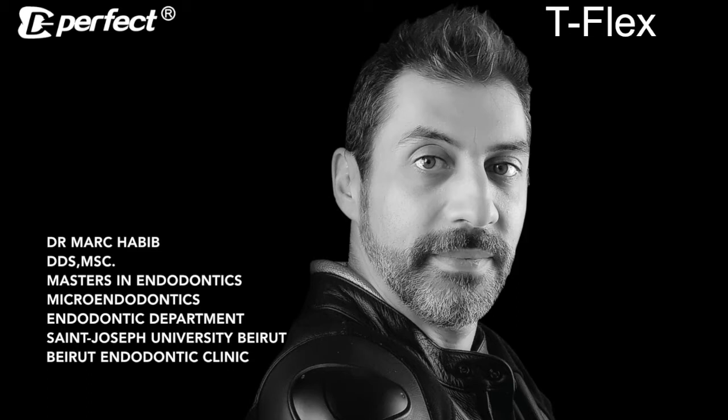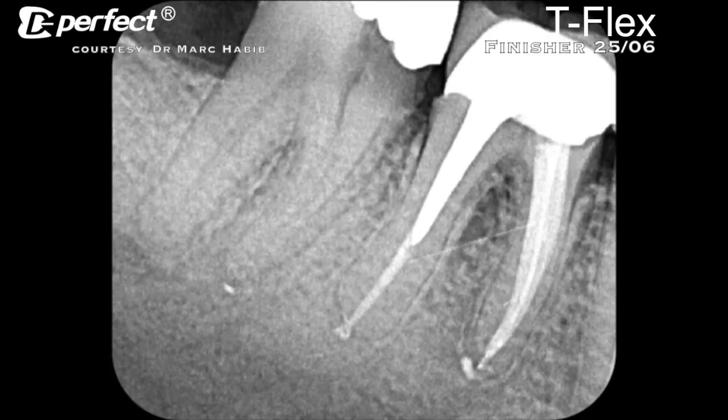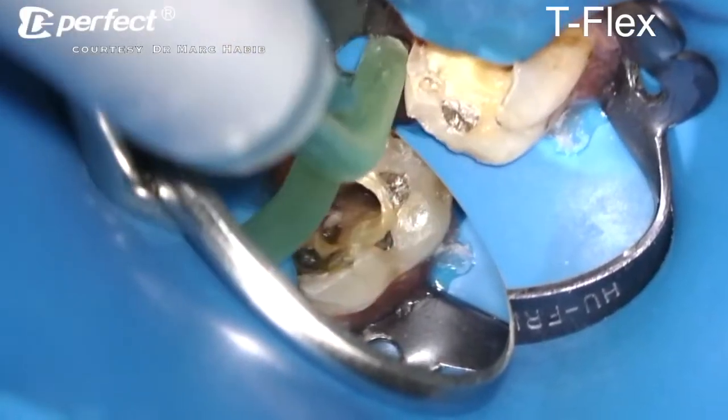I am Mark Habib. I'd like to share with you this clinical case using the T-Flex system from D-Perfect. It is a case of a lower second molar with pulpitis.